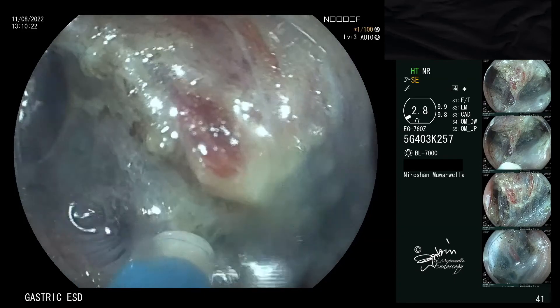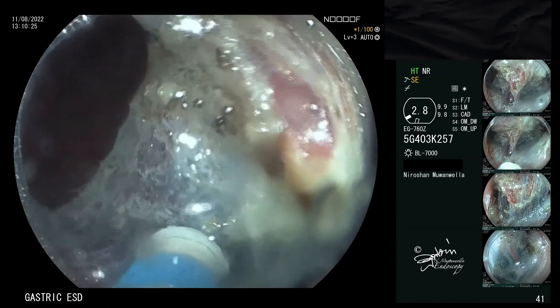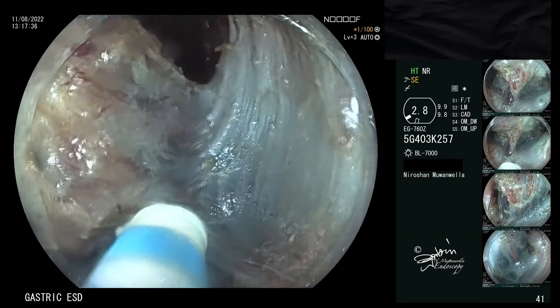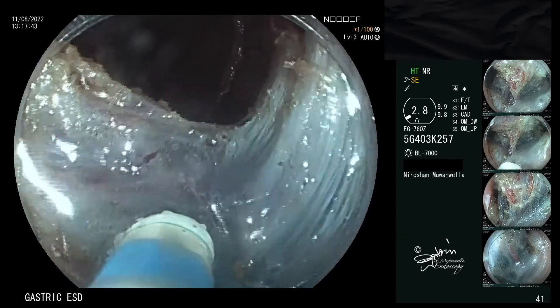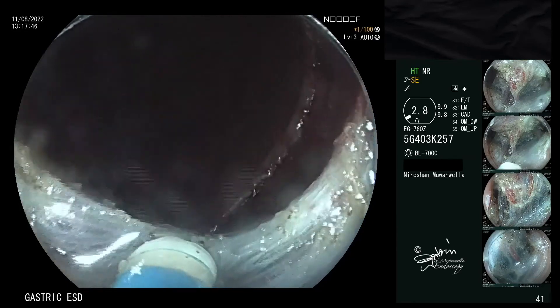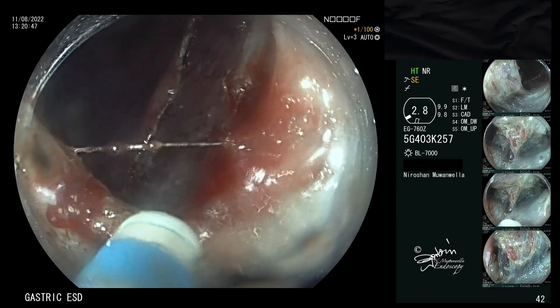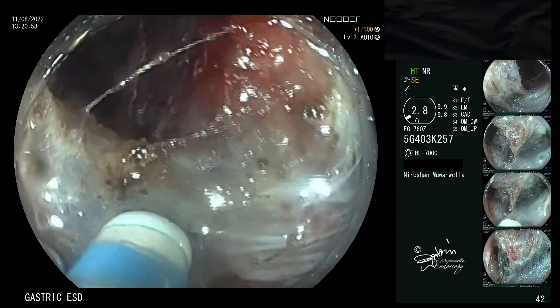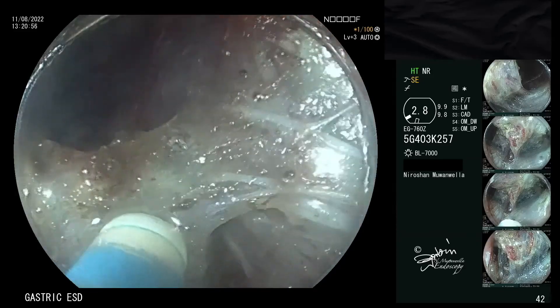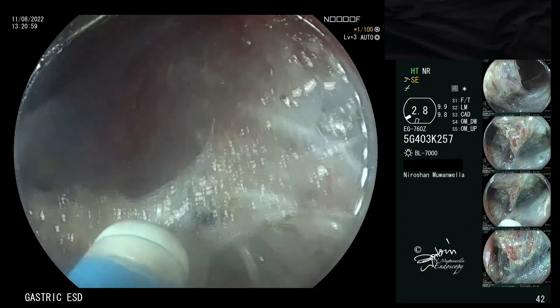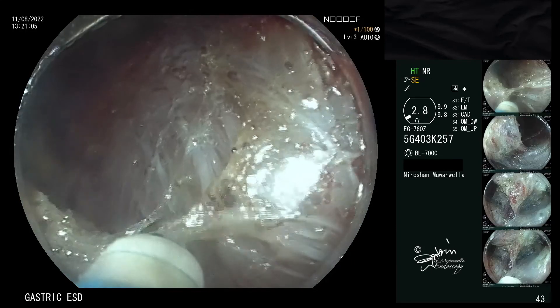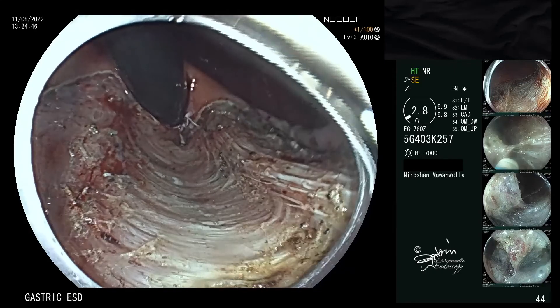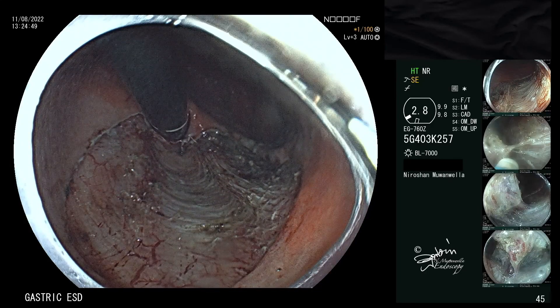Gastric cardia is one of the most challenging locations for endoscopic submucosal dissection. Employing a traction method makes cardia ESD easier. Here you can visualize the mucosal defect following completion of the ESD. The sling fibers can be clearly seen in this retroflexed view.